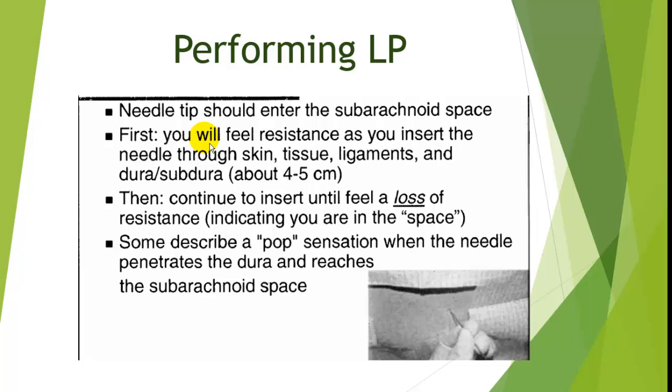And you put it into the midline, angling it upwards about 30 degrees or so, or towards the location of the umbilicus. And you just keep advancing it. If you hit a bone, that will be pretty obvious. You won't be able to advance it any further.